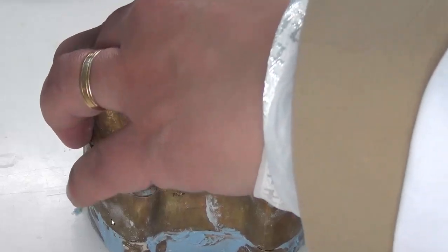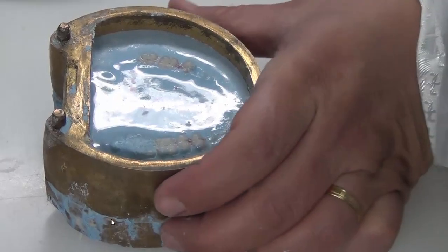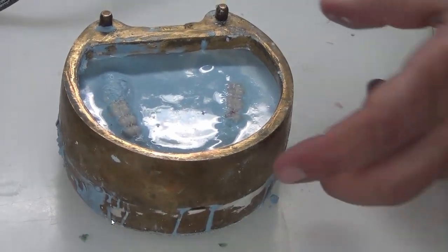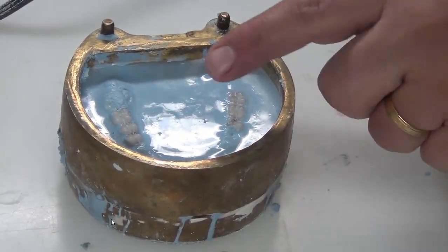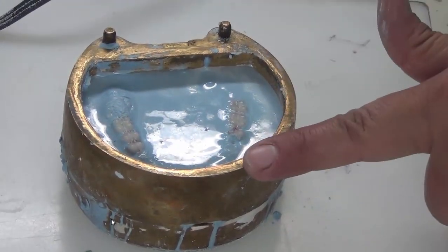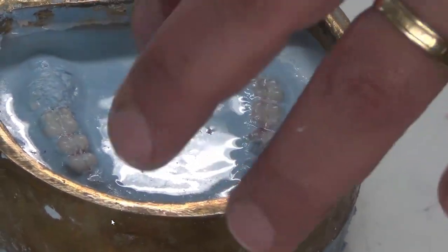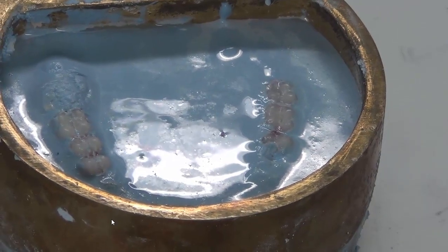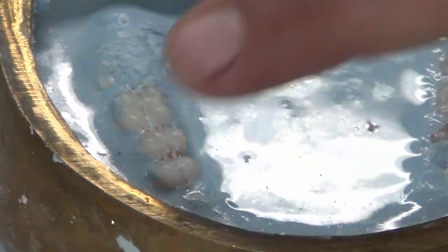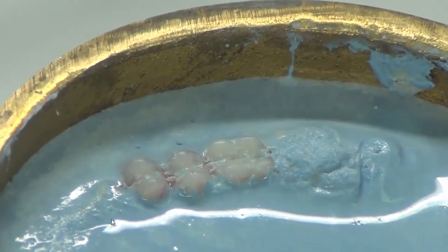Once this is ready, we also check our upper member of the flask. We need to make sure that the occlusal surface of the teeth is not above the rim of the flask. If the teeth are above the rim of the flask, that means we did not sink in the denture or the cast enough in the first step. We have to sink in the denture or the cast enough to make sure that the occlusal level of the teeth is lower than the rim, so we don't have an interference.